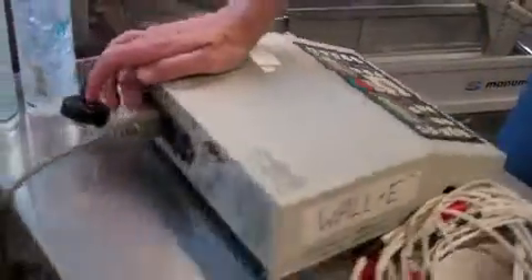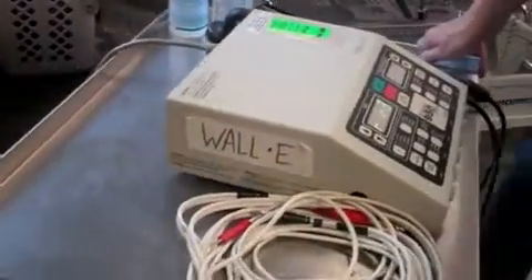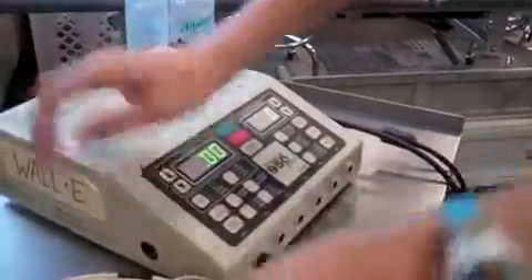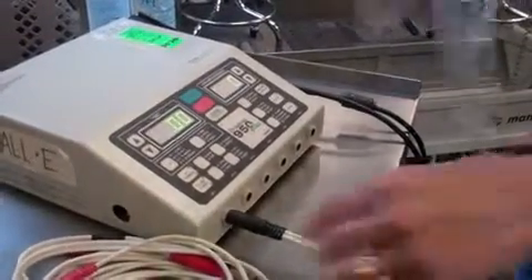We're going to do electrotherapy on the Dynatron. The on-off switch is in the back, so I'll turn it on. We're going to start with pain control, and we'll do this using the IFC current.